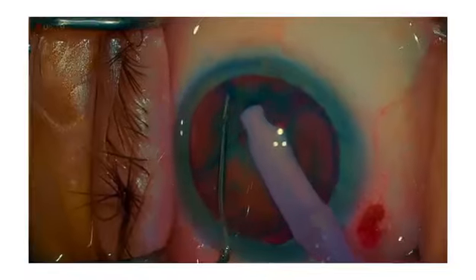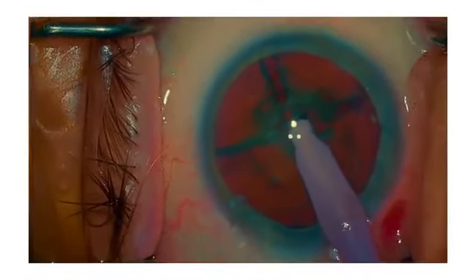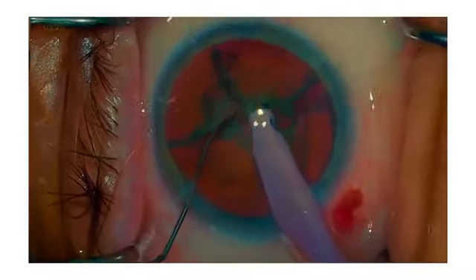Outflow is the fluid that leaves the anterior chamber. In an ideal setting, with a closed chamber, this will be controlled entirely by the aspiration rate of the machine, but it will be increased or unbalanced if there is wound leak. If the inflow and outflow are balanced, constant anterior chamber pressure will be maintained.